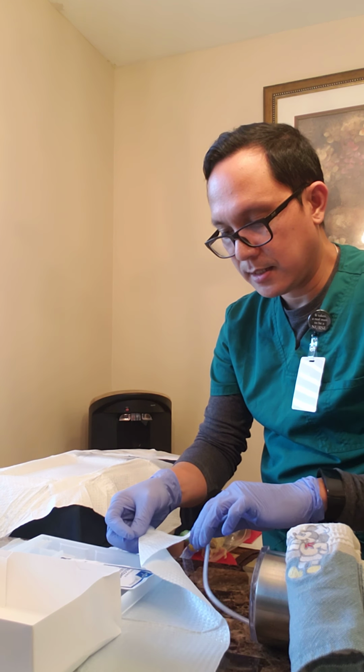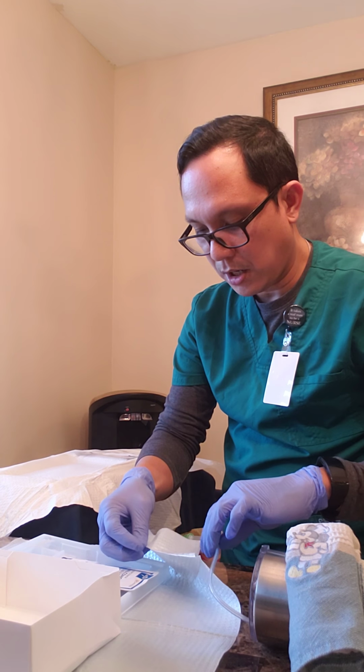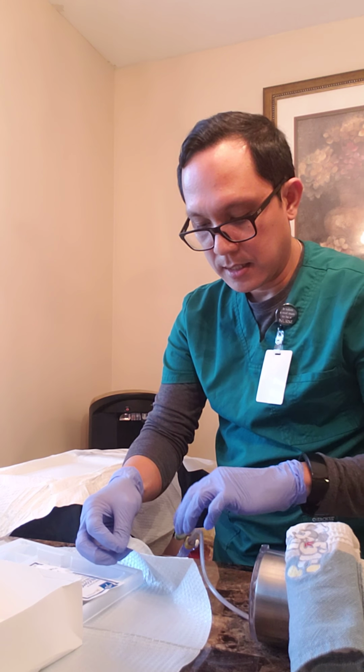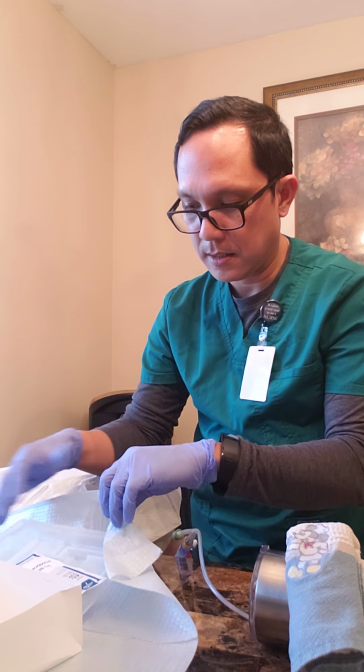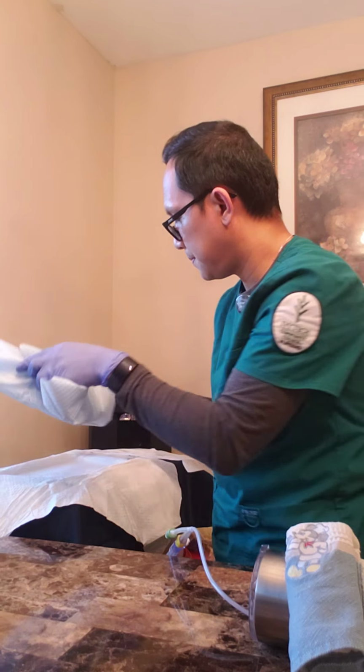Then once I've got that done, I'm now ready to gather all my supplies and dump them in the proper receptacle.